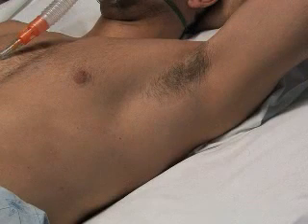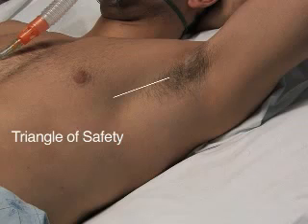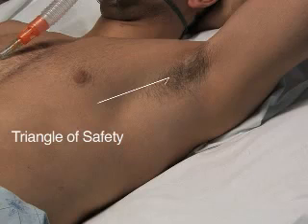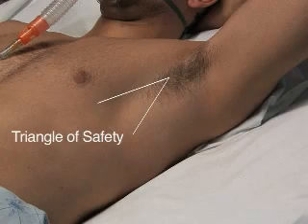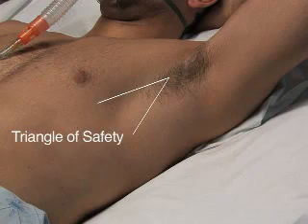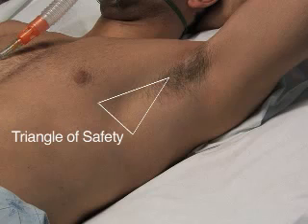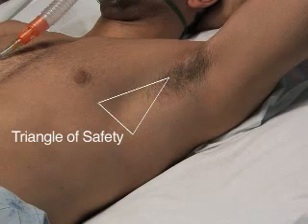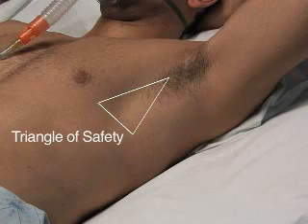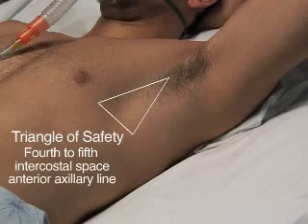The ideal location for the placement of a chest tube is in the triangle of safety — the anatomical region defined by the lateral border of the pectoralis major muscle anteriorly, the mid-axillary line posteriorly (which is also the anterior aspect of the latissimus dorsi), the apex just below the axilla, and the horizontal level of the nipple inferiorly. The triangle of safety should approximately lie between the fourth and fifth intercostal space in the anterior axillary line.